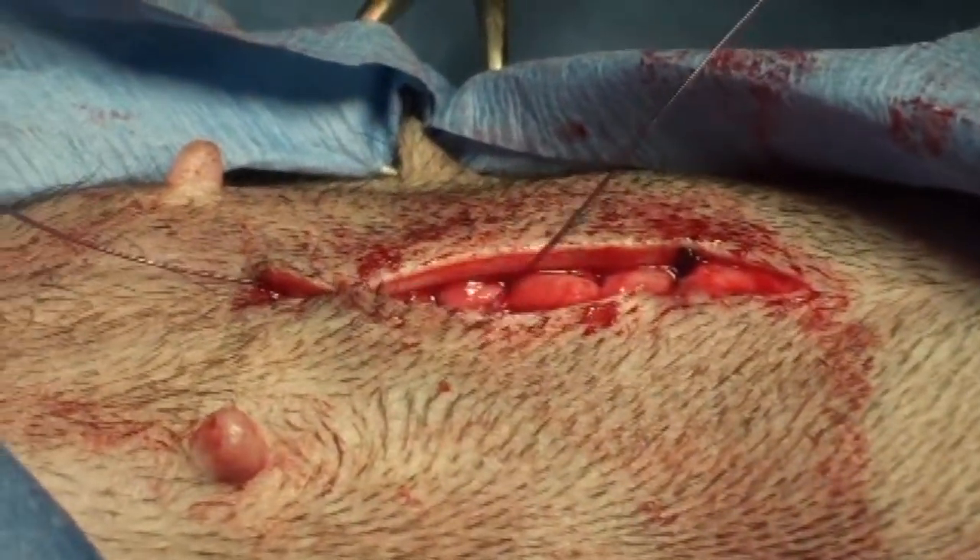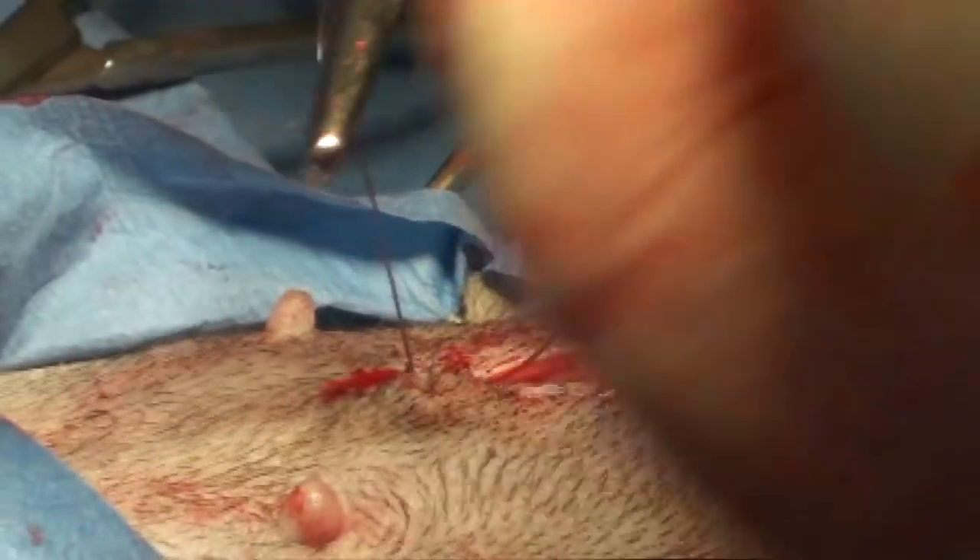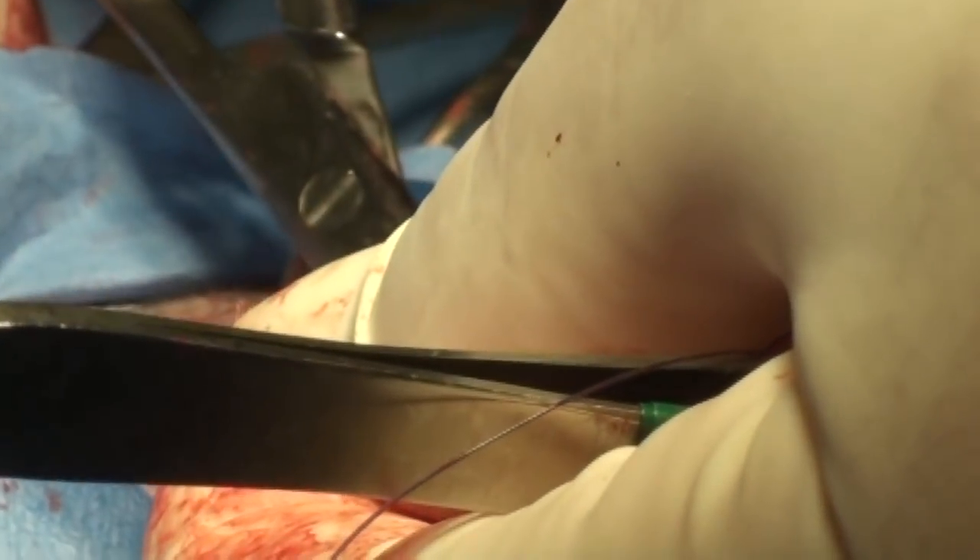Get this spare suture out of there. Then we tie a knot and the knot gets pulled into the incision because of the direction I put the needle, so it doesn't want to stick out the top. We don't want it to stick out the top.